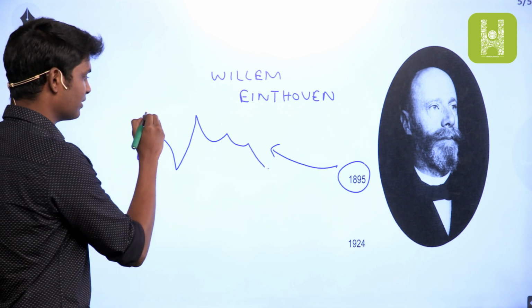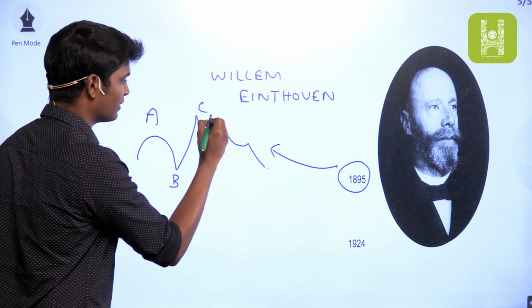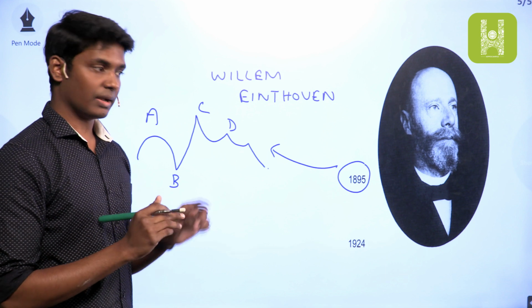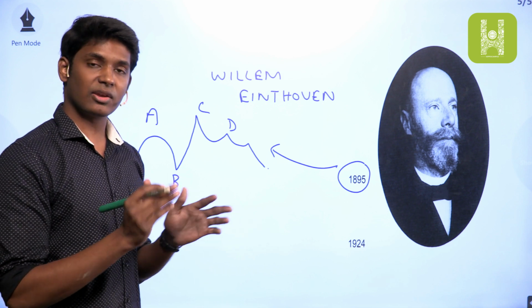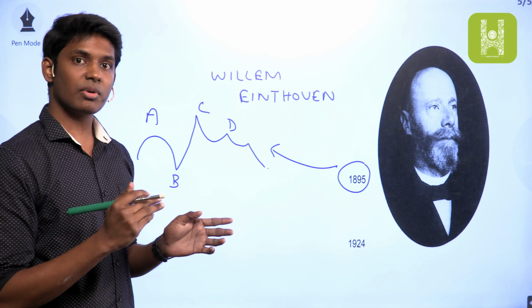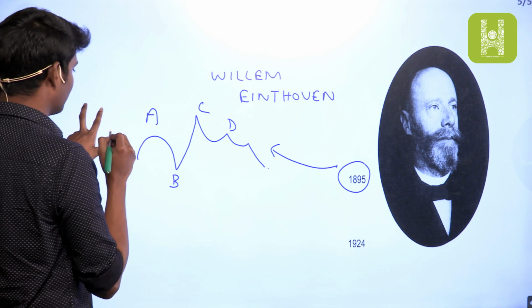So he named them as A, B, C, and D. And to correct for the Lippmann capillary electrometer's inaccuracies, he devised certain formulae incorporated into it, and he was able to identify a more refined tracing which appeared like this.